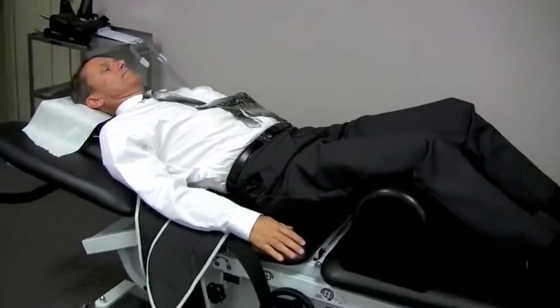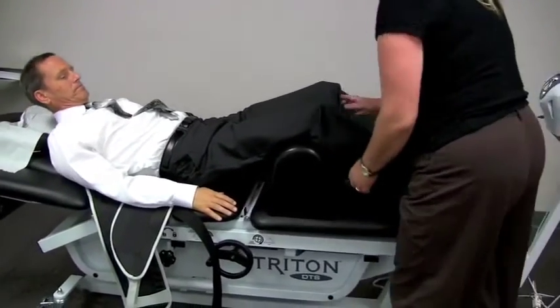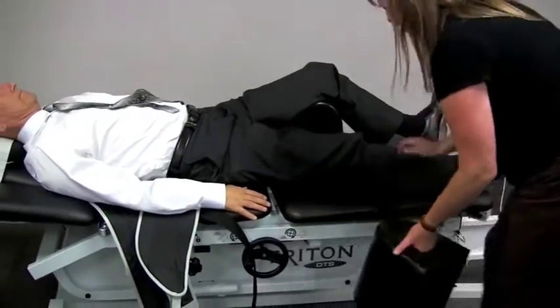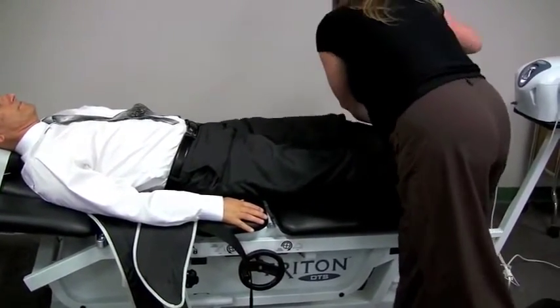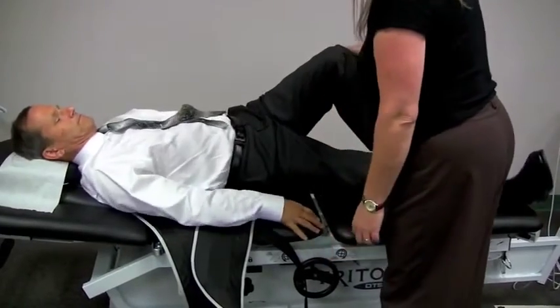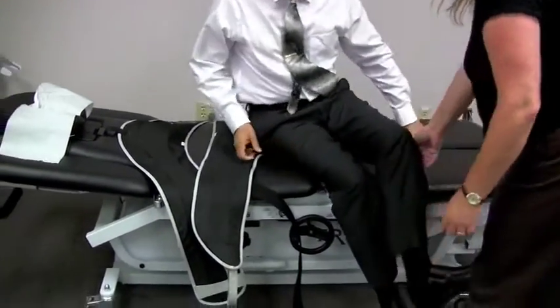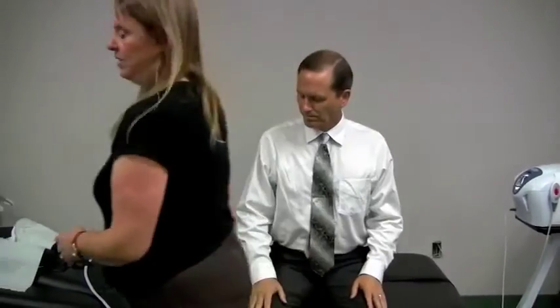Now I'm going to have you come off to this side of the table. But first, let's go ahead and get rid of these one at a time. One leg down, another leg down. And I'm going to have you get on your side. And just ever so carefully get on your side. We'll come to a seated position, swinging the legs off the table. Now, if he was very much in spasm, we'd be quite concerned. We'd have to do a lot slower with more doctor assistance.